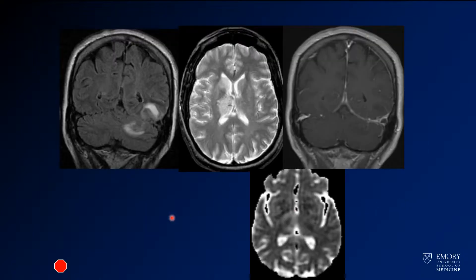Going on to an MR, what you see is there's edema, and interestingly it's crossing the tentorium. So you have some edema here in the left cerebellar hemisphere as well as the left inferior parietal and occipital lobes. It also looks like there's some abnormality in the right thalamus there.